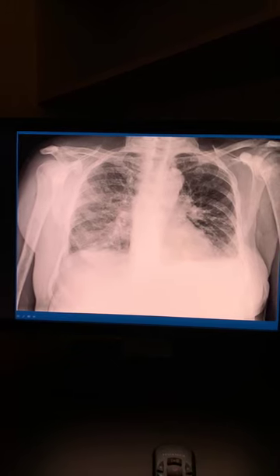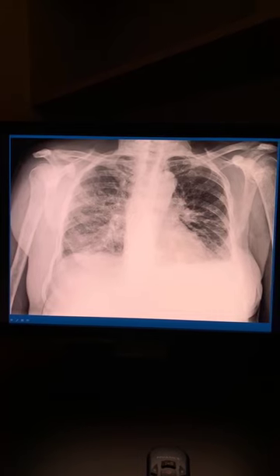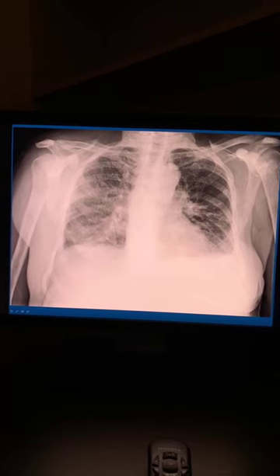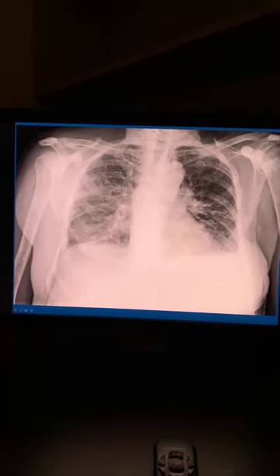An absolute lot. Remember, anybody who's heard me talk before, radiology is a puzzle. I don't just diagnose A and then diagnose B and not try to correlate those together. That's not how I work. I look at A, I look at B, I look at C, I look at D, and I go down the alphabet and then I try to figure out how they all connect together.